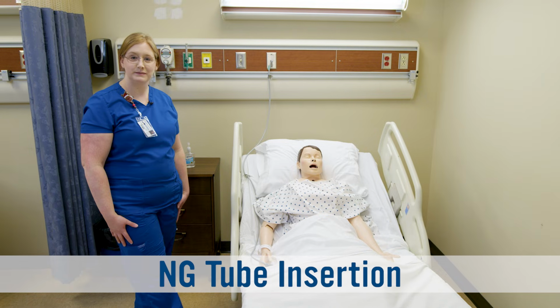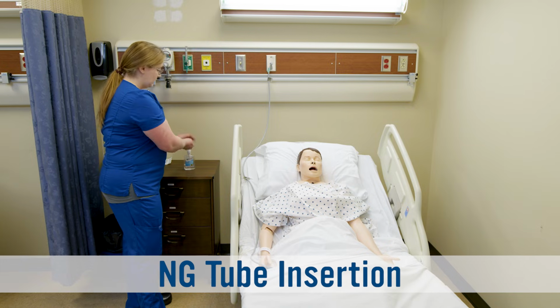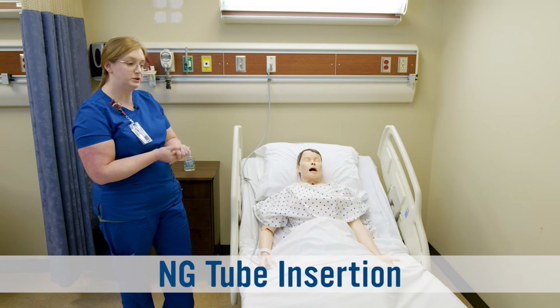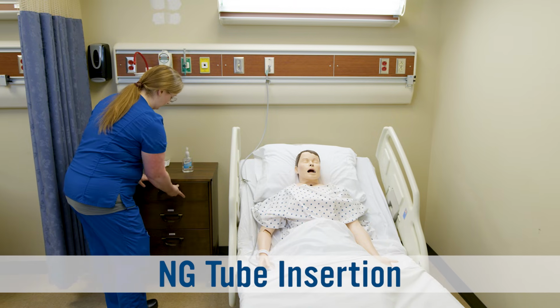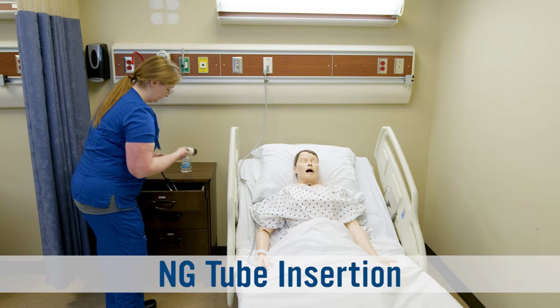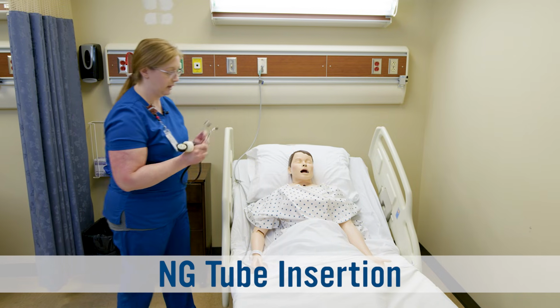All right, I'm going to go ahead and demonstrate NG tube insertion. First, I'm going to provide hand hygiene. I'm going to go to my patient's room and do a focused abdominal and respiratory assessment. Want to make sure I'm listening to all the lung fields and all the areas of the bowel.